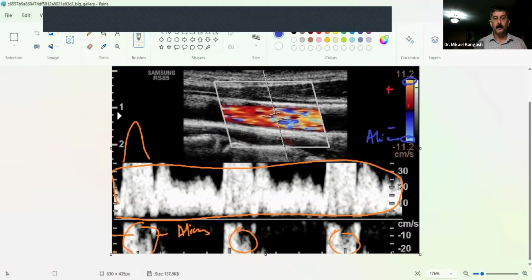This is spectral Doppler with aliasing. And you can even say the tip of whatever had been aliasing here is too big. So the tip of aliasing is being aliased. Maybe that's because the scale was too small for it. Did that make sense, girls? Sorry. Good.